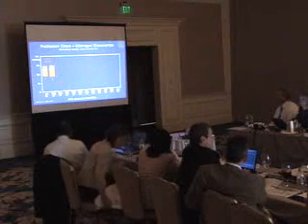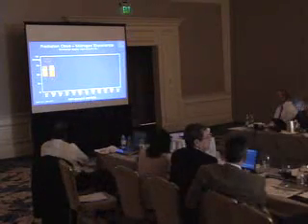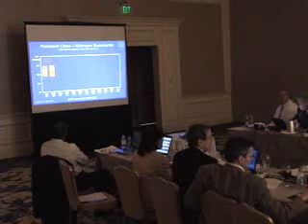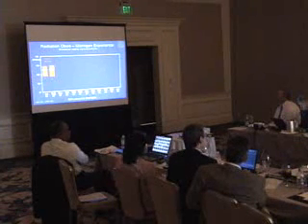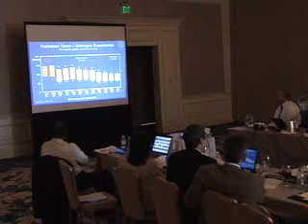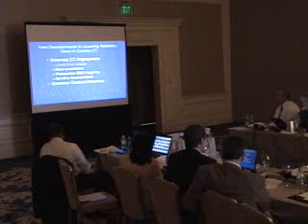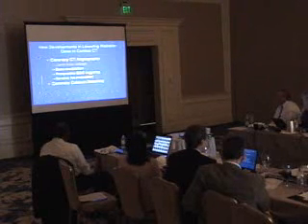Gil Raff, knowing this, set up a registry in Michigan in which everyone in the state of Michigan, in order to get Blue Cross to cover this coronary CTA, had to take part in a registry. As part of the registry, they reported their radiation doses, and then there was feedback about how they stood compared to the other centers, and there were approaches given to the people on how to improve their radiation doses. In the control period, and then the intervention period that followed, and finally in the validation period, there was a marked change in the amount of radiation associated with coronary CTA. The overall reduction was 53% over time during the course of that registry.